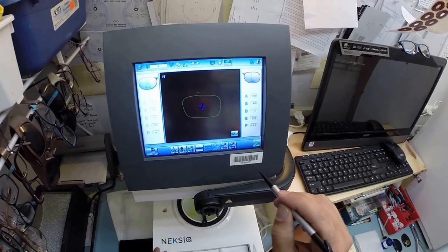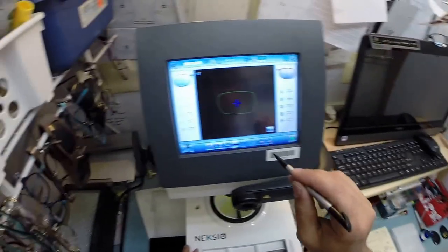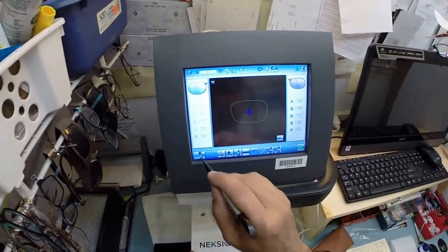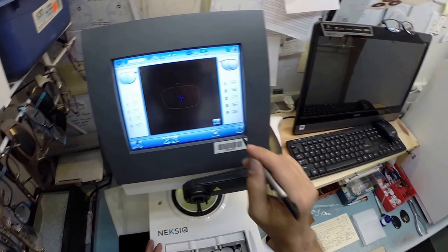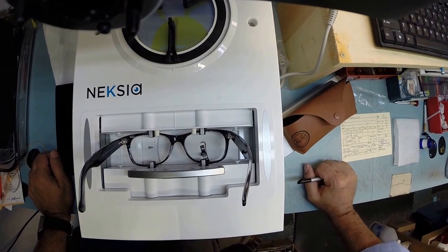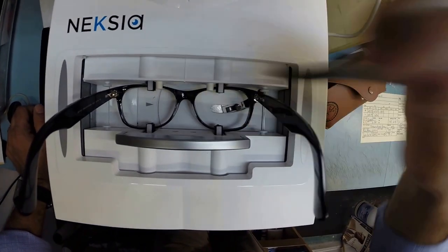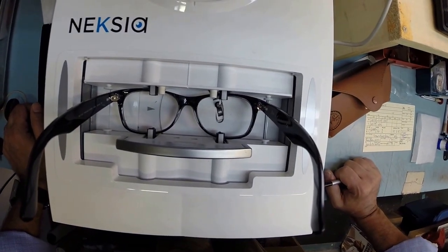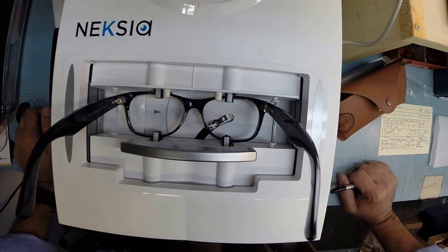I got to hit a couple buttons here. There we go. Now this little stylus is going to go around and trace the shape of the right lens before moving over and tracing the shape of the left.